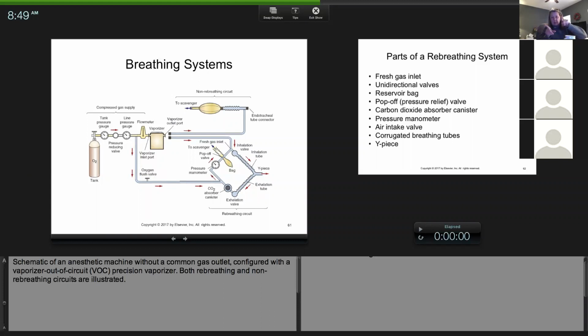So if you were doing the flow for that question number 1, you almost have to do like a split. Yeah, that's where I was getting confused. I was like, I'm not sure where that fits in. As long as you put the flush valve right before or after the flow meter, just know you almost kind of have to put that to the side, and that's fine if you do that on the homework. I just want you to know the main thing is that the flush valve connection is set up so the flow goes around the vaporizer. On the drawing, it looks like it's way out here.